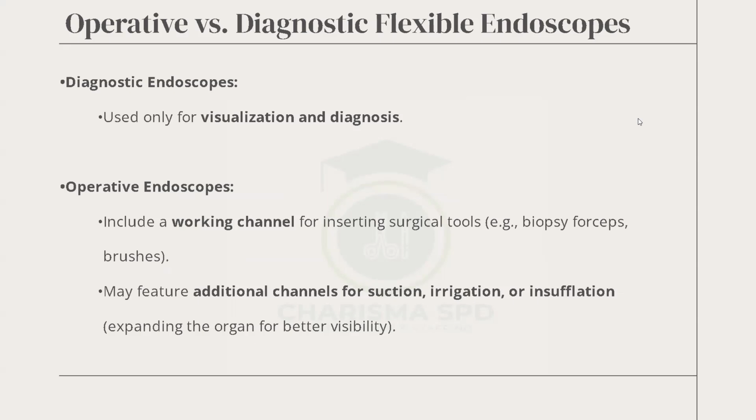All right. Operative versus diagnostic. Flexible endoscopes. So diagnosis means to diagnose. It's not for treatment. It's just to diagnose, to look and say, oh, you are suffering from this. So those cases, those surgeries are quick. 15, 20 minutes and it's done. They just watch and take a biopsy, go and run tests. That's it. Visualize and diagnose.